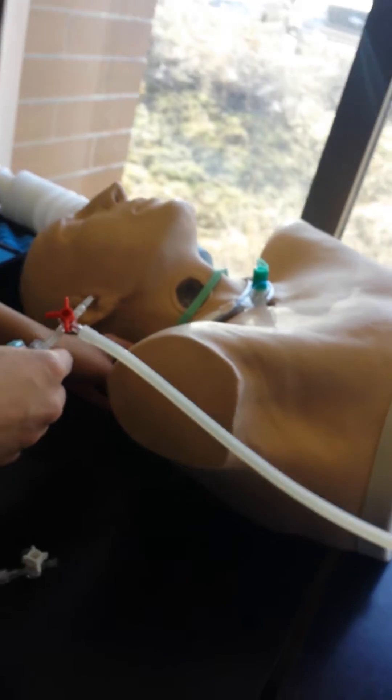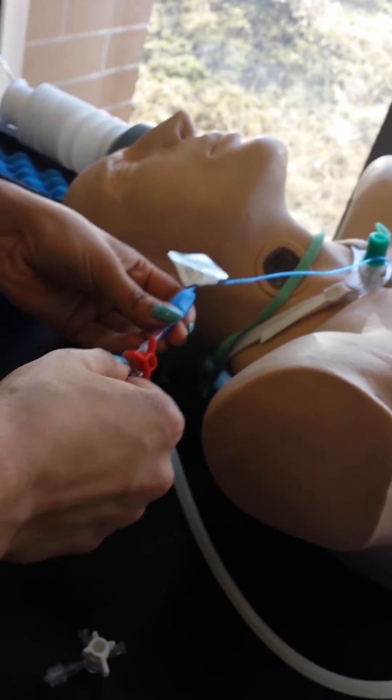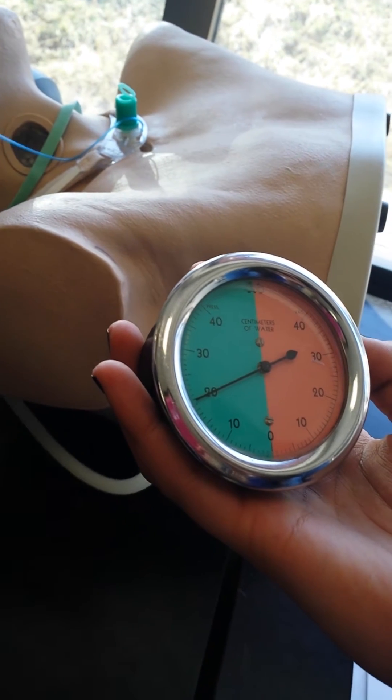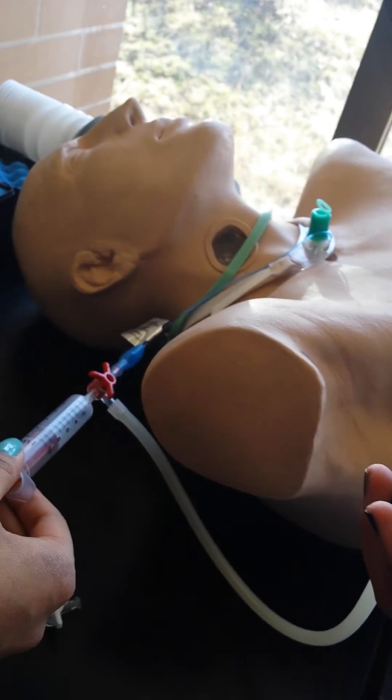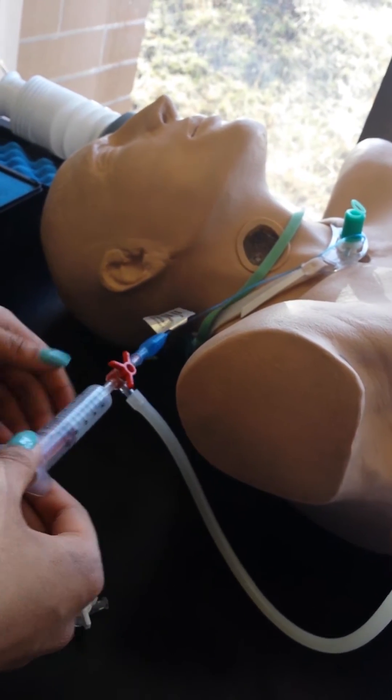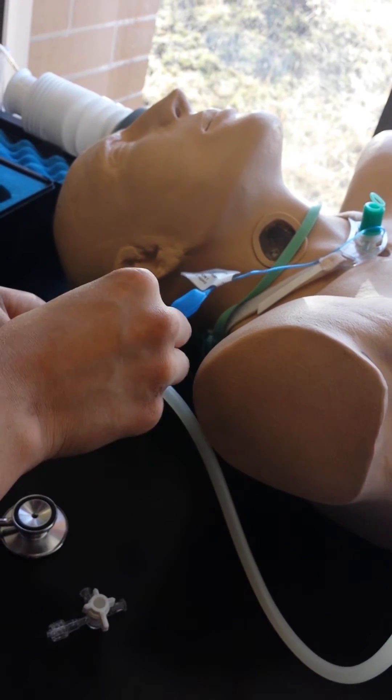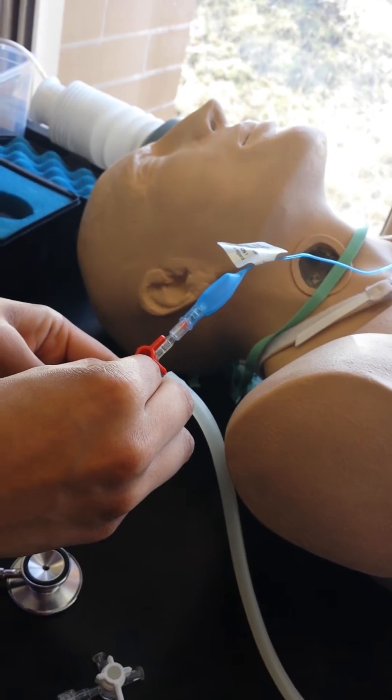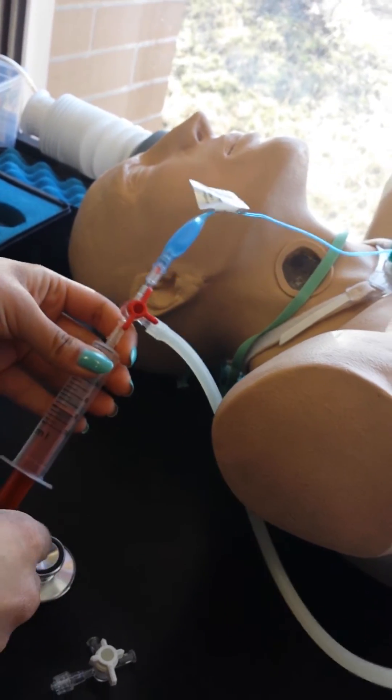Now we're going to attach it to the patient. You're going to plug into the patient. And then when that happens, we might see a drop in here, but no, because we just set that before. Now she's going to open all three lines to the patient. You point all three to each tube, so that means that every single line is open.